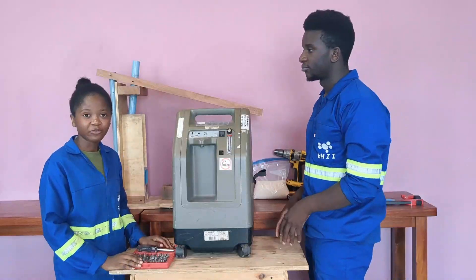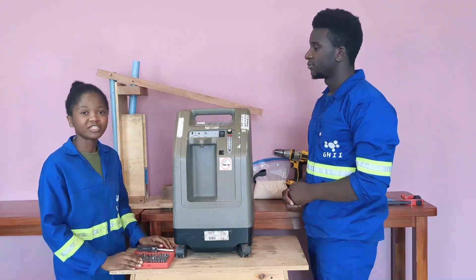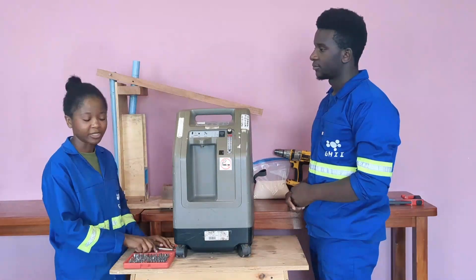For the DeVilbiss 525 oxygen concentrator, we need a T25 bit to open it.